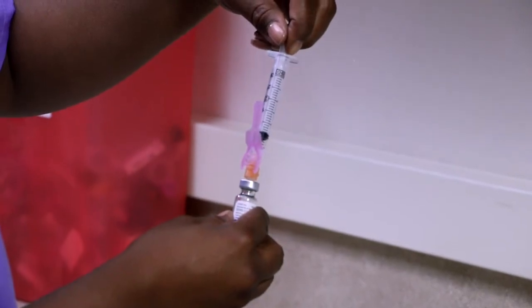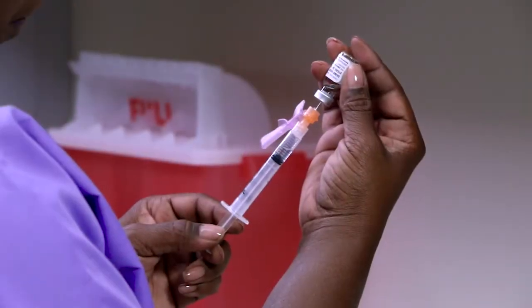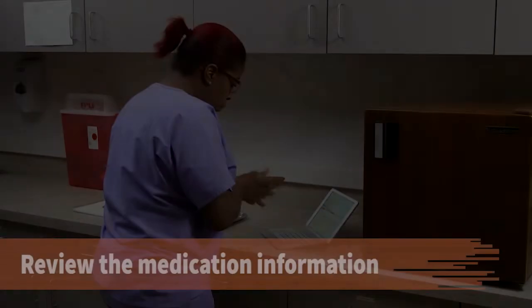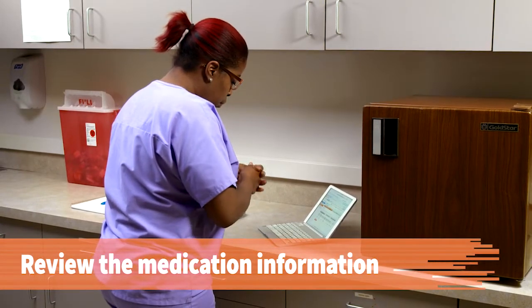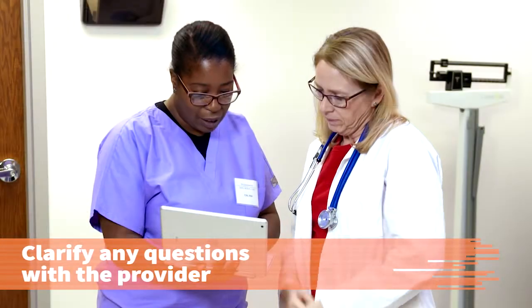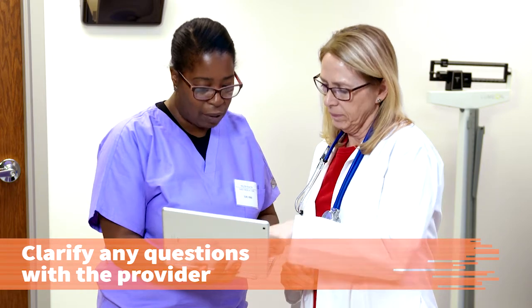In this procedure, you will learn how to reconstitute powdered medication and prepare a dose of medication for the patient. Using the drug reference information and the provider's order, review the information on the medication. Clarify any questions you have with the provider.